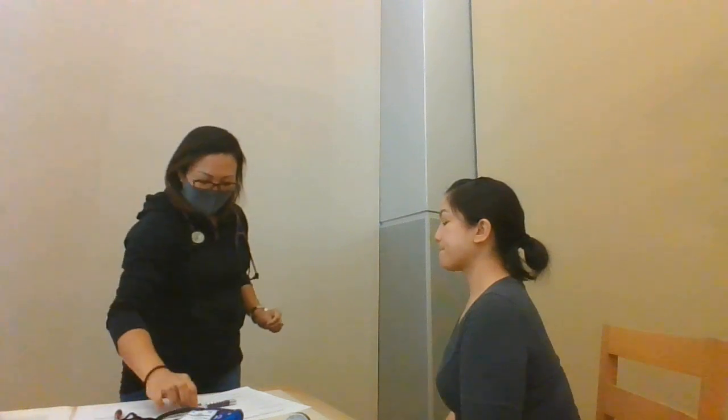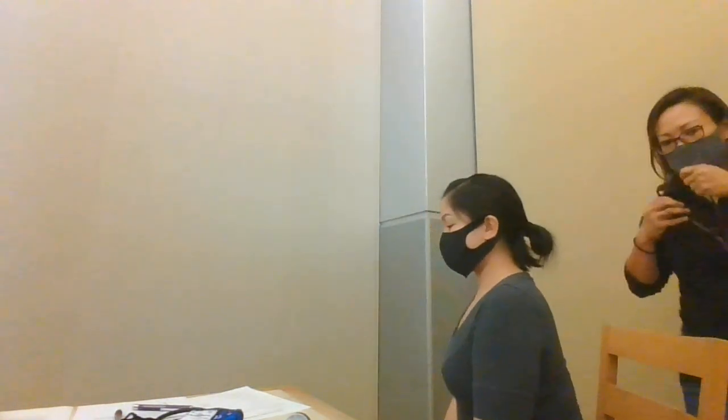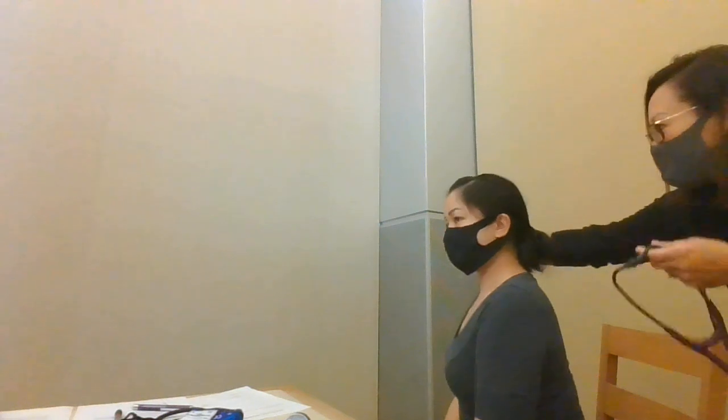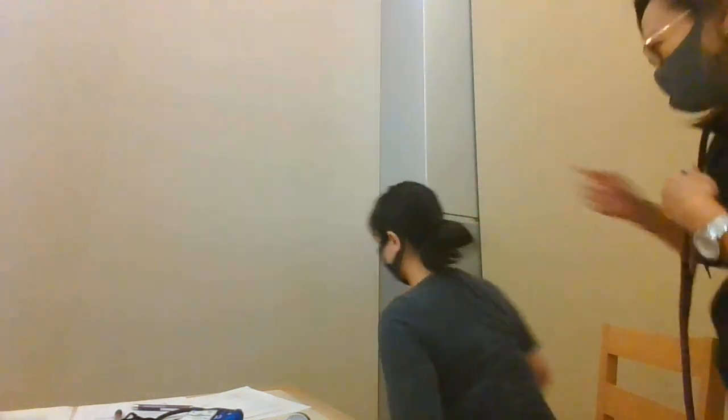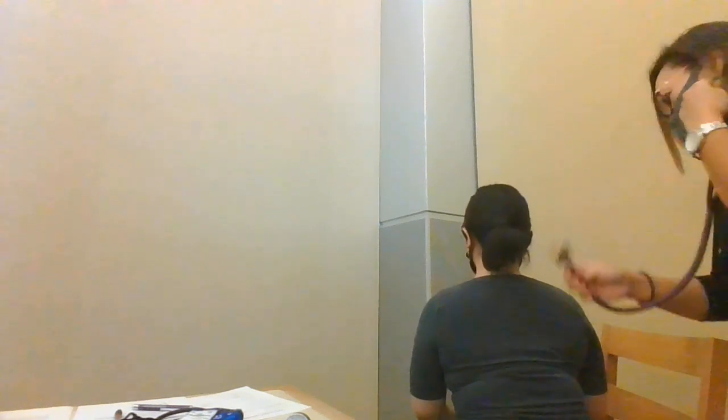And let's do the lung sounds now. Okay, so I'm going to go ahead and listen to your lungs. Facing that way for me, please. Towards that wall. Thank you. Now, when you feel my stethoscope, I just need you to take a deep breath. Okay?